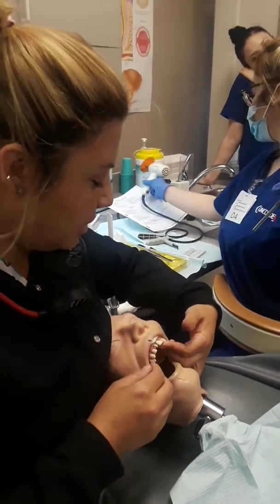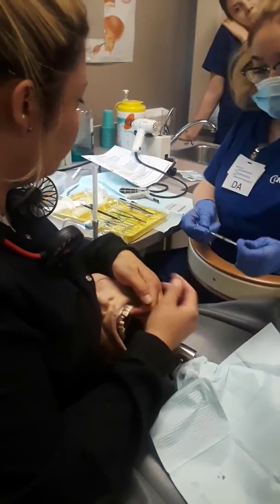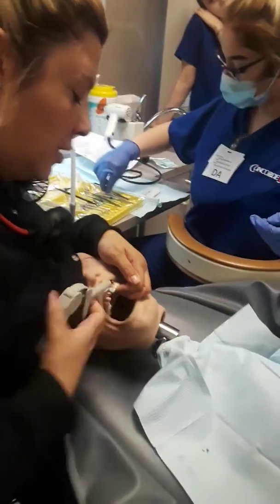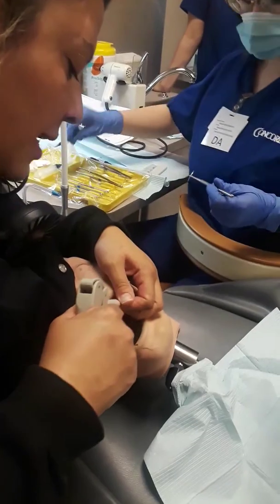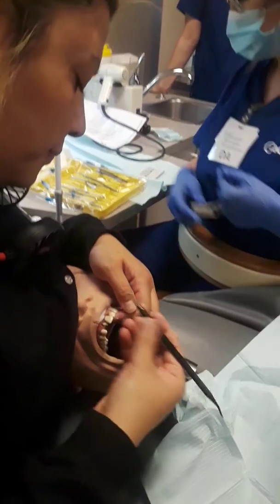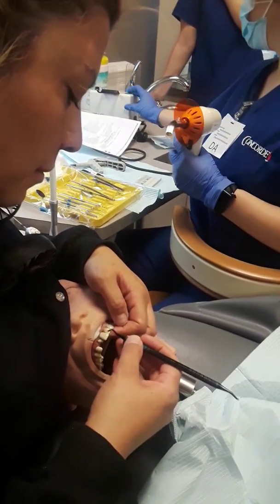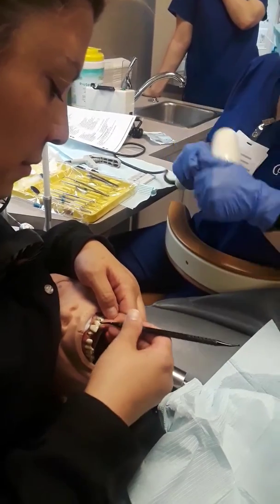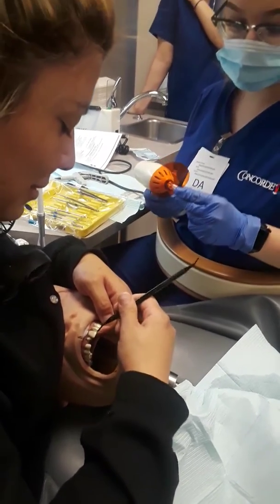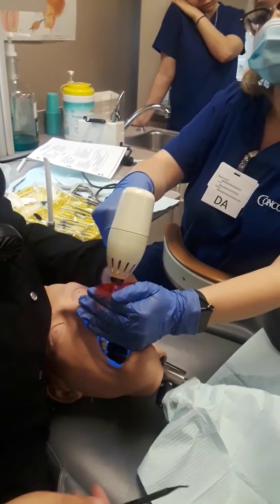We're going to look again — pass a little more composite to make sure I fill my proximal surface. Pull the matrix tight again — we should have a tight contact now, hopefully.